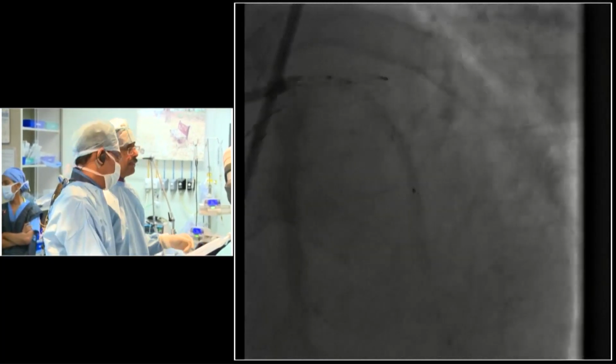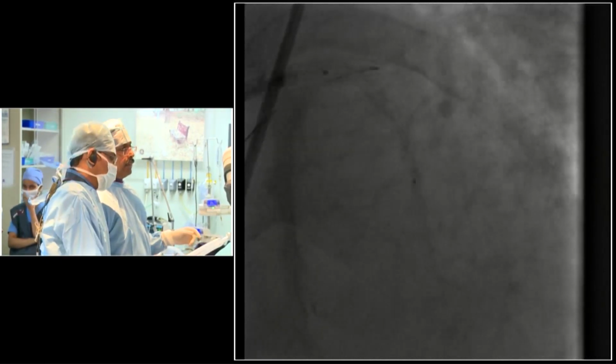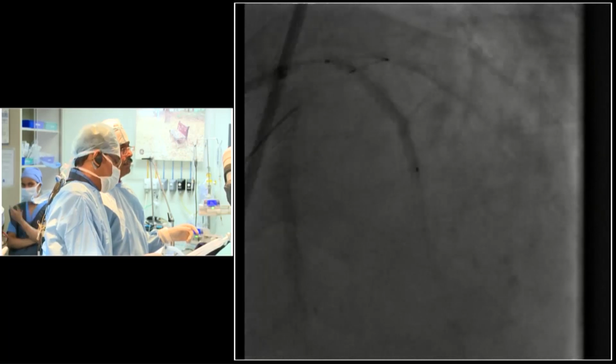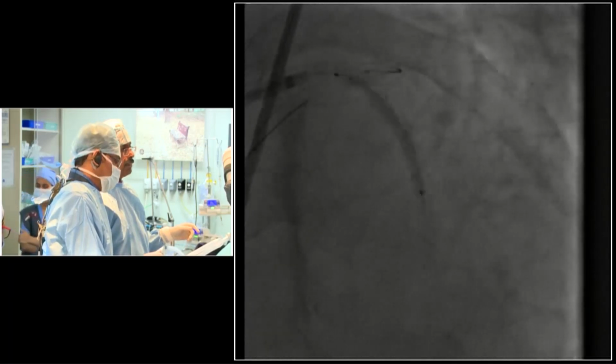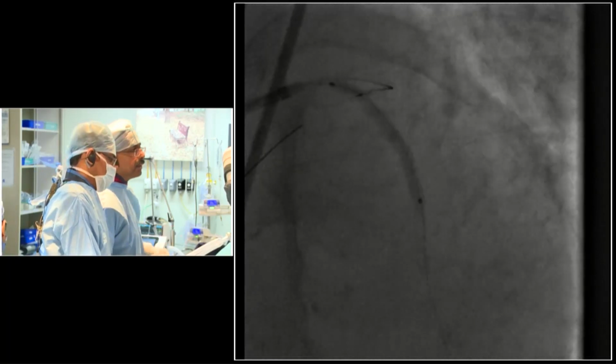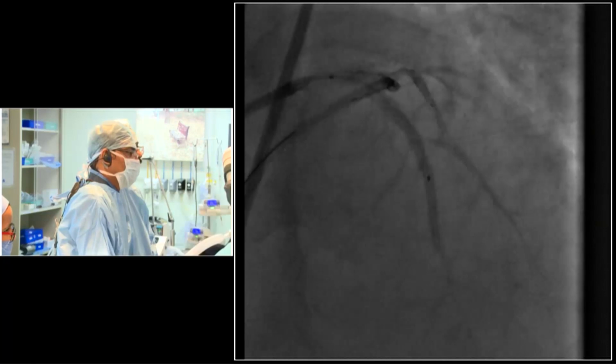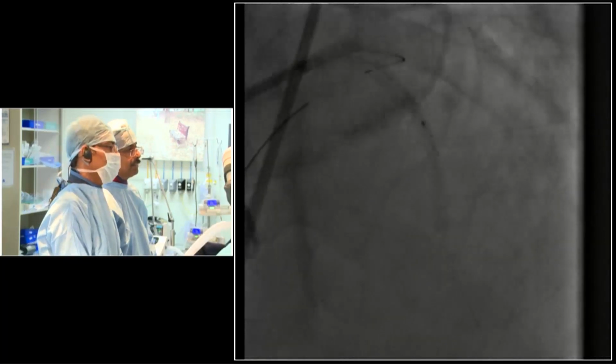That's okay, go ahead. Anyway, we're going to start. I don't want the diagonal to get occluded. So overinflate there and the diagonal may get occluded. 10, 12, 14, 16, 18, 20. Vijay sir, if you do so, sometimes the diagonal may get obstructed. We are not typically going to very high pressure. You should see that at least before there was a flow.